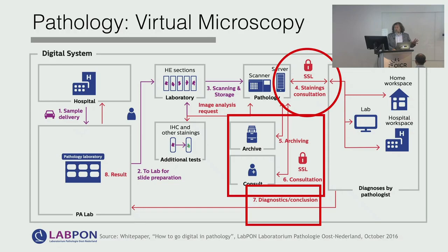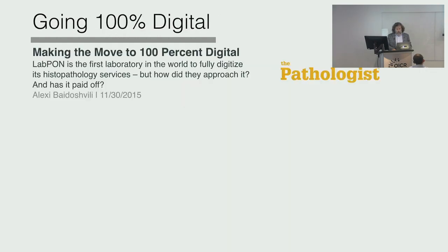So storage-wise, you need high-end, high-performance storage. You cannot just put it on HDD. You need SSD type of storage. So this type of thing could be regarded at the same time as a challenge or a benefit of going digital. People are doing that. People are going 100% digital.